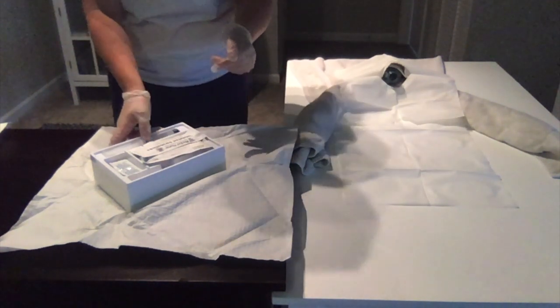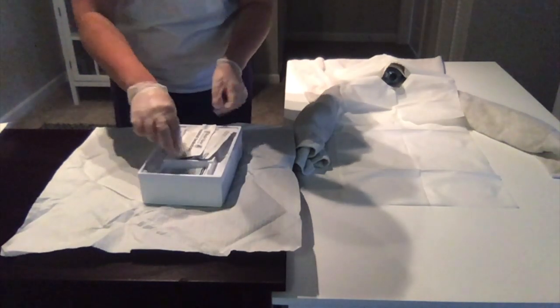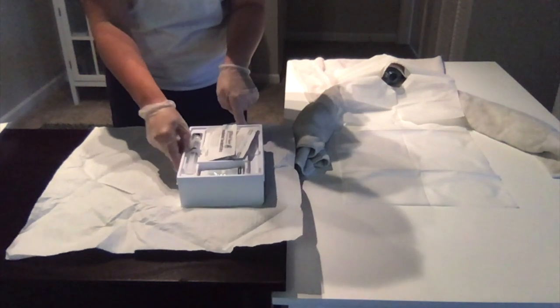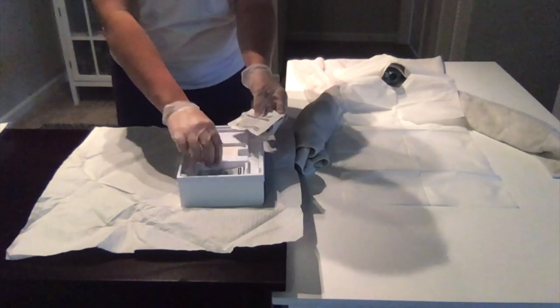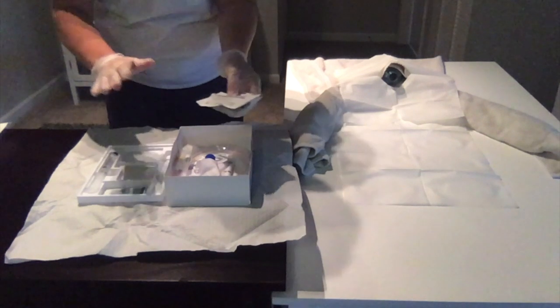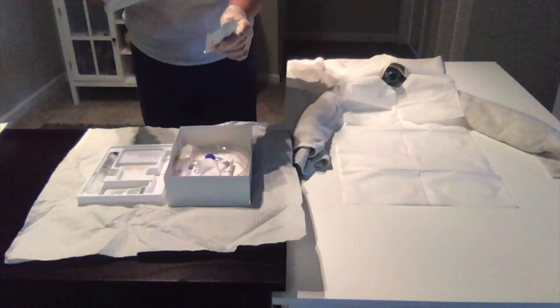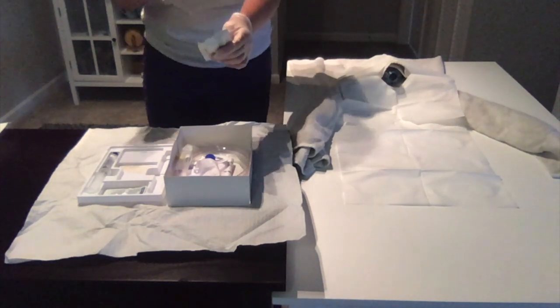Then I'm going to get my supplies ready. I'm going to go ahead. I'm minding the 1 inch border around, also keeping my arms nice and tall. And I'm going to put it side by side. Okay? So I can get rid of this by maintaining height, stepping away from the table, and dropping it into the trash. I don't need it.